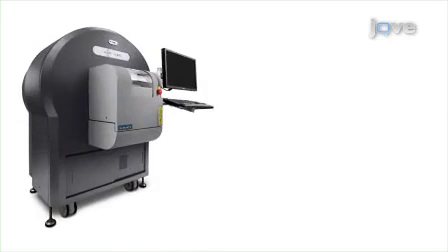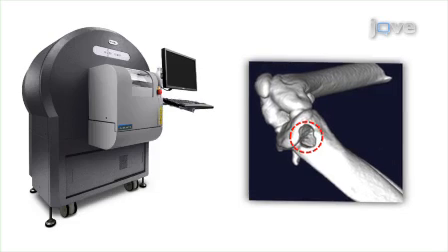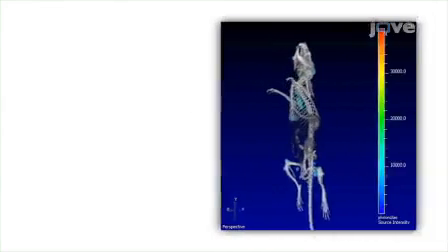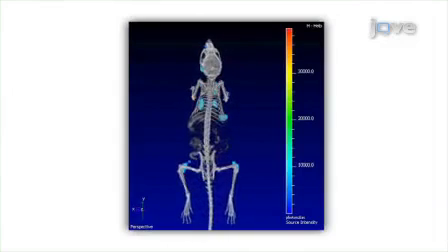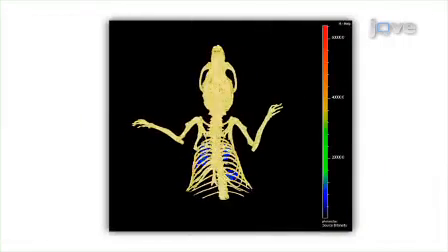These anatomical changes can be measured using high-resolution techniques such as micro-CT. For longitudinal imaging, a low X-ray dose is essential to minimize the effects of the cumulative radiation on the underlying biology. These optical and micro-CT images can then be co-registered to provide a combination of functional and anatomical data, ensuring that the maximum amount of information is extracted from the animal model.